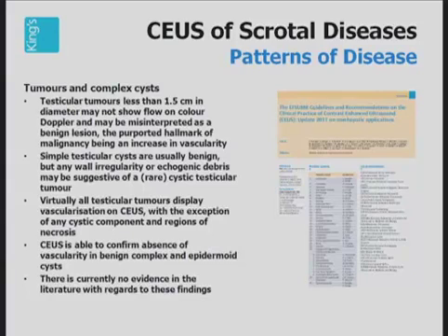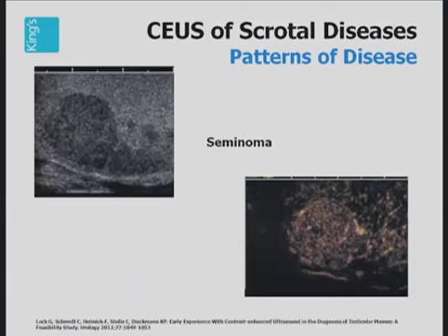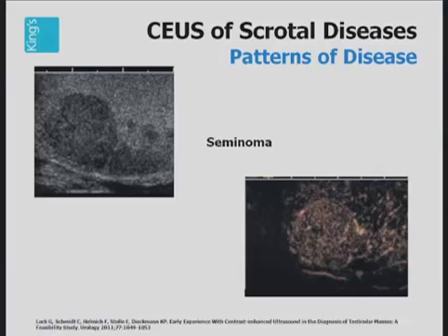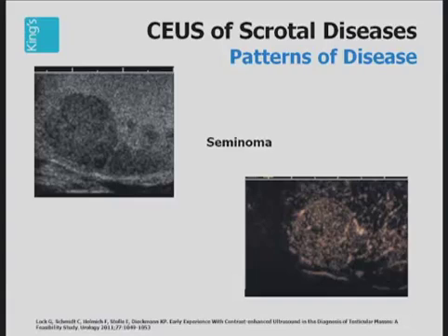There is, however, very little evidence in the literature with regards to these findings, and a lot of this is based on personal experience. This is a large seminoma in the testes measuring over 1.5 centimeters. There is clear demonstration of vascularity in the tumor following the administration of contrast. The parenchyma is less enhanced. Experience shows that this vascularity is very transient, lasting anything between 20 and 30 seconds before the tumor washes out.